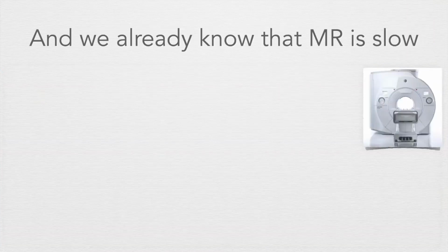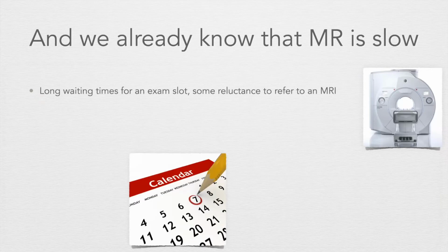We already know that MRI is a slow modality, and we have long waiting times for an exam slot. There's also some reluctance to refer to an MRI. If you are a doctor and you have a patient, maybe you want to refer them to a quicker CT scan instead, because MRI has always been viewed as a bit of a luxury. That is starting to go away, but MRI is still a bit hard to get a referral to sometimes.